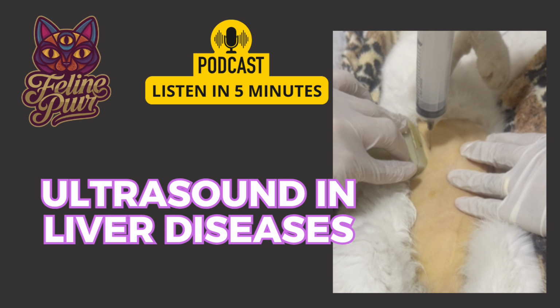In summary, ultrasound is an indispensable tool in the evaluation of hepatobiliary diseases in cats, allowing detailed visualization of the liver, gallbladder, and bile ducts. Careful interpretation of the images, in conjunction with other clinical and laboratory data, is essential for an accurate diagnosis and an appropriate treatment plan.